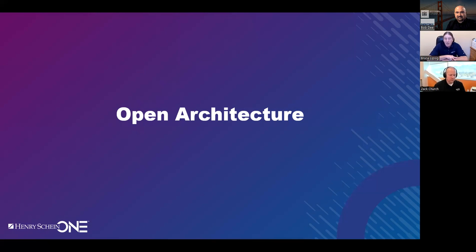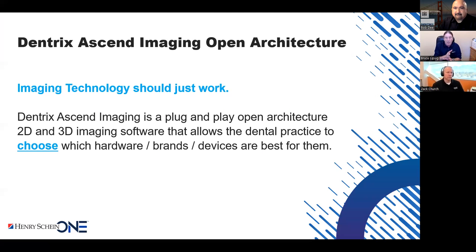And when I talk about open architecture, I don't mean just supporting other devices. I mean making them work properly for the practice. Because sometimes they handicap one or the other hardware device, so that if I'm running the hardware that came with the software, it runs perfectly. But if I add additional hardware, it's now not running the same. It has to go through additional steps, etc. We don't have a horse in this race, Dr. Bob. We are open architecture, and we try as hard as we can to make all the technology and devices work to the best of their abilities for the doctor.